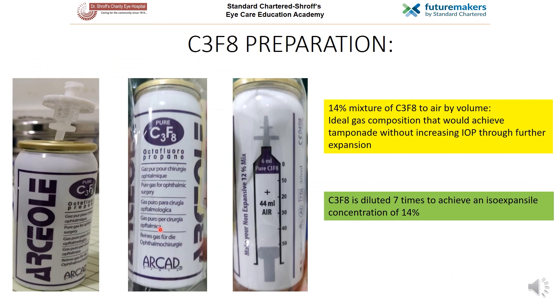This is how a C3F8 cylinder looks. An air filter is used for obtaining sterilized gas for air Desmatopexy. A 14% mixture of C3F8 to air by volume is the ideal gas composition to achieve tamponade without increasing IOP through further expansion. C3F8 is diluted 7 times to achieve an iso-expansile concentration of 14%: 0.1 ml of C3F8 gas is aspirated from the cylinder using an air filter in a tuberculin syringe, then completed with room air up to the 0.7 ml mark. If a 2 ml syringe is used, 0.2 ml of C3F8 is aspirated and completed with room air up to the 1.4 ml mark.